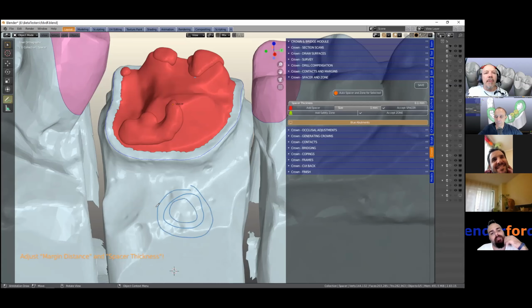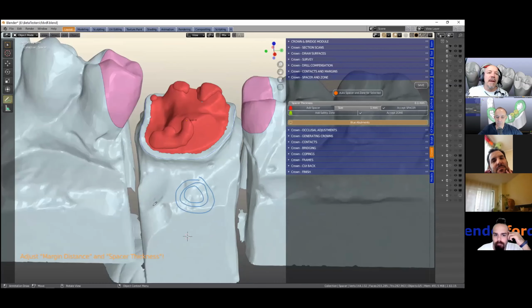The other problem I see with that whole system is that if you've got a complex shape like an MOD, you want to scale this outside bigger, but this you want to scale inwards. This is the problem that I personally see with any scaling factor. Cylindrical shapes, fine.